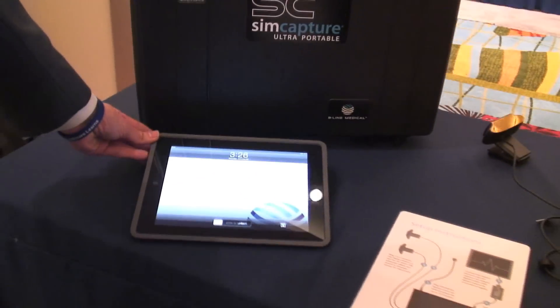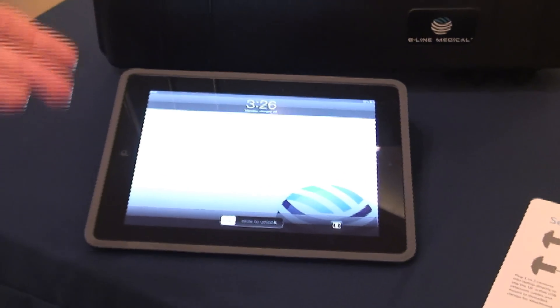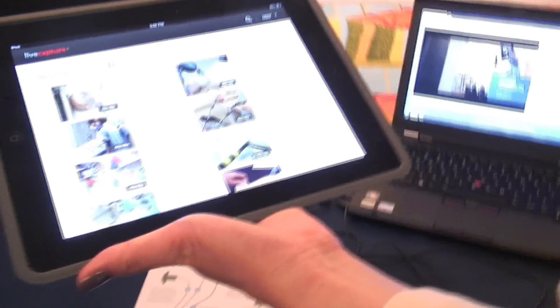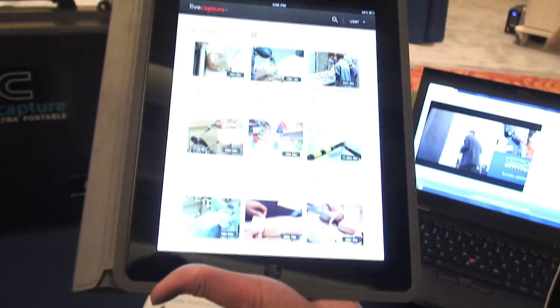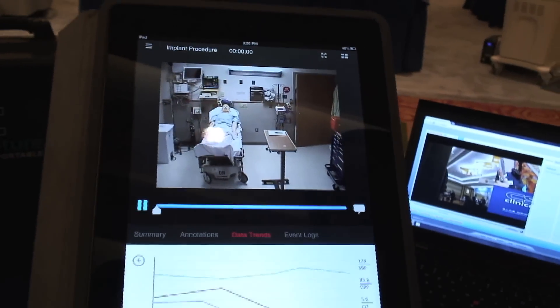Now, this iPad here is not necessarily connected directly with the Ultra Portable, but this is a new debriefing software coming out soon from Beeline. In late summer, we are going to see the iPad debriefer. This is just a prototype for now, but as you can see, you can pull up all of your sessions. It rotates from landscape to portrait mode, and you'll be able to debrief any of your sessions. You can hit play and it'll actually play.